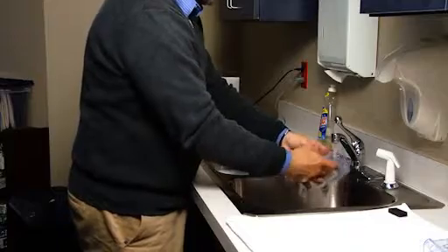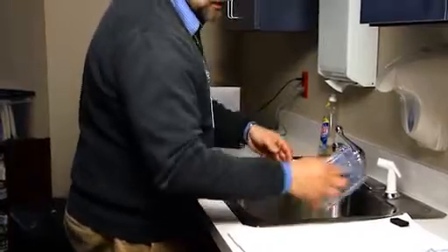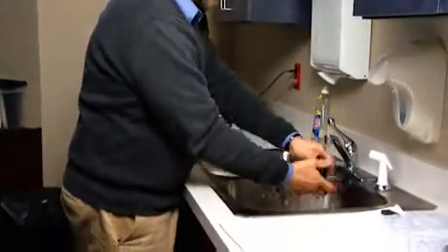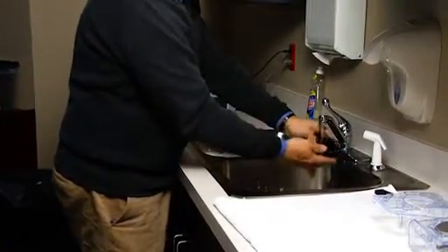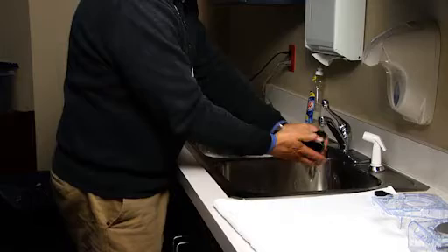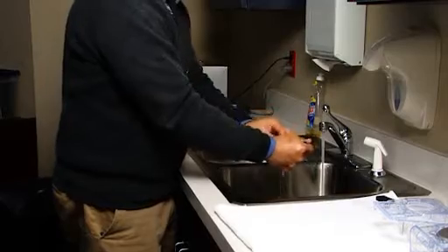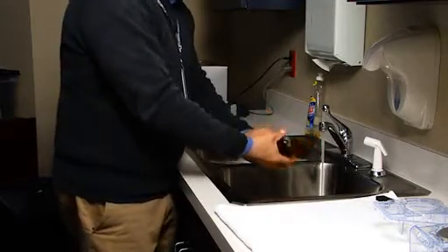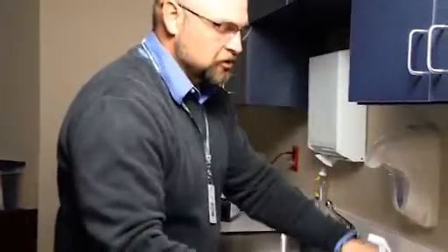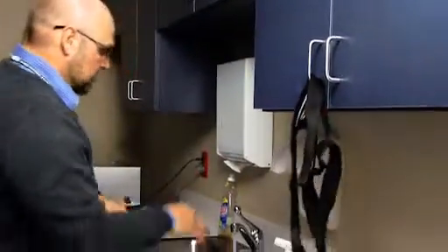While I'm doing this, the outside of your CPAP, you can take a damp washcloth or maybe a paper towel and just lightly rinse that down, and just keep it clean. Your headgear, you want to rinse it off good. What I'm using for soap in the sink is a mild dish soap, Dawn, Joy, Ivory. You can use that, or even the manufacturer sometimes will recommend a facial soap or something that's that mild. You just want to make sure that you're not allergic to any of the soaps that you're using. This we can hang up because it's just a hang to dry.